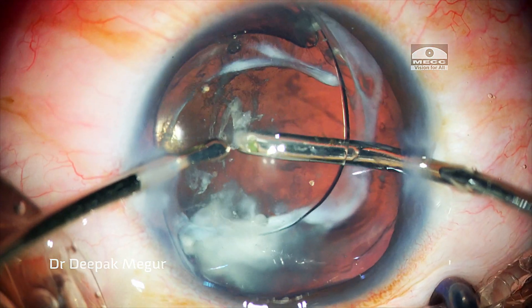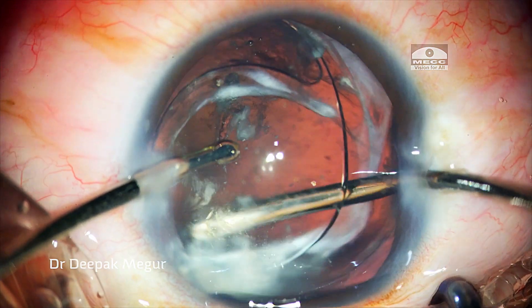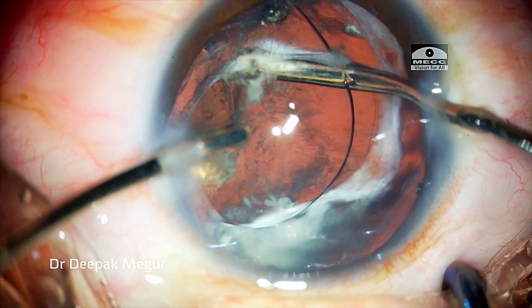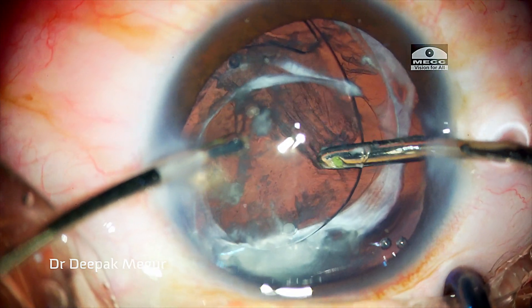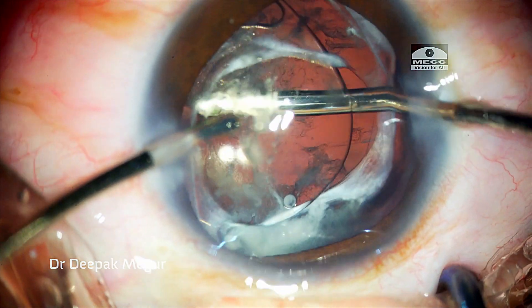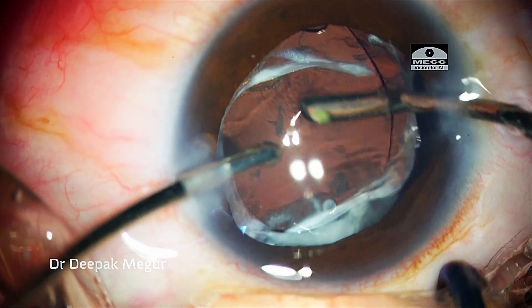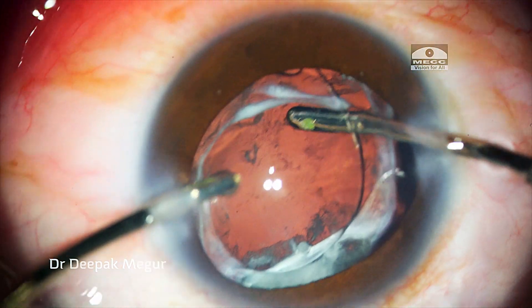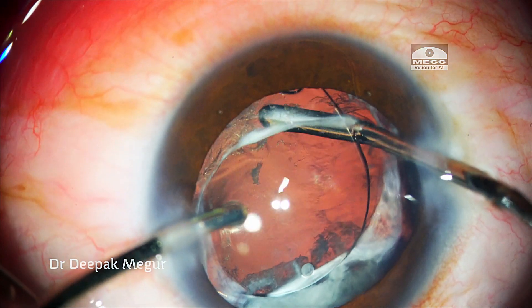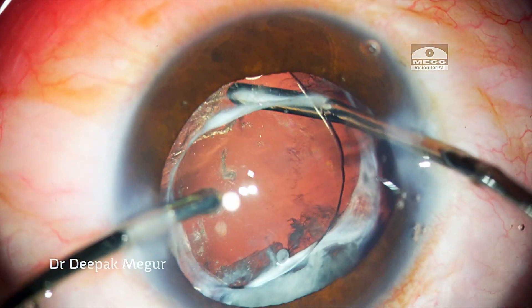I go in with my aspiration cannula behind the lens and begin to aspirate the Elschnig pearls and also the proliferated lens fibers. It does take some time to clean out the lens material, but in just a few minutes the visual axis is very clear.